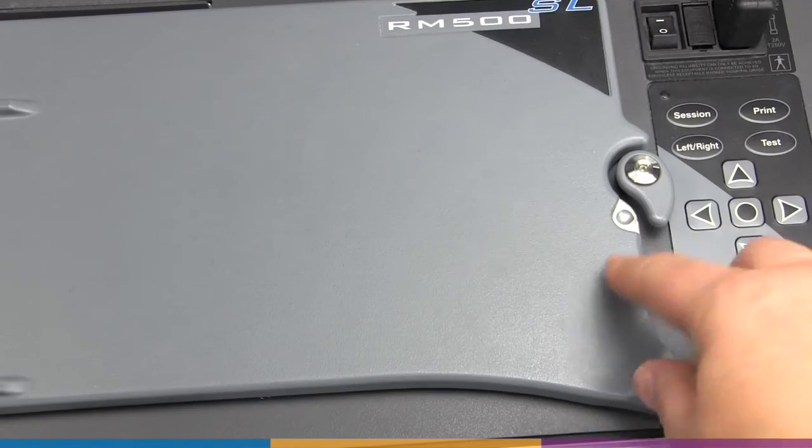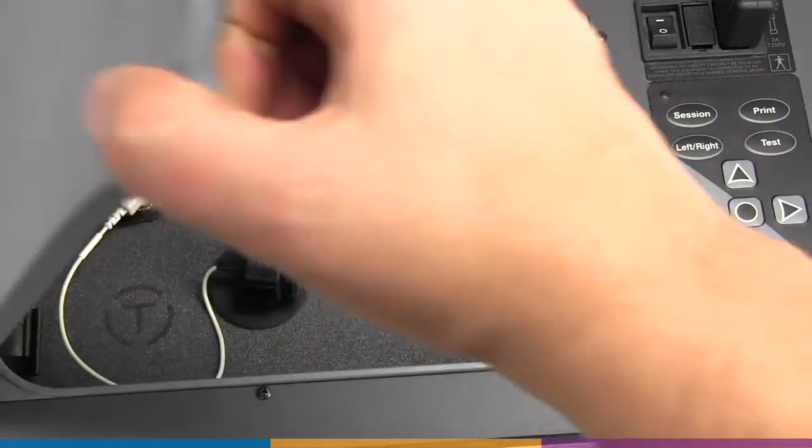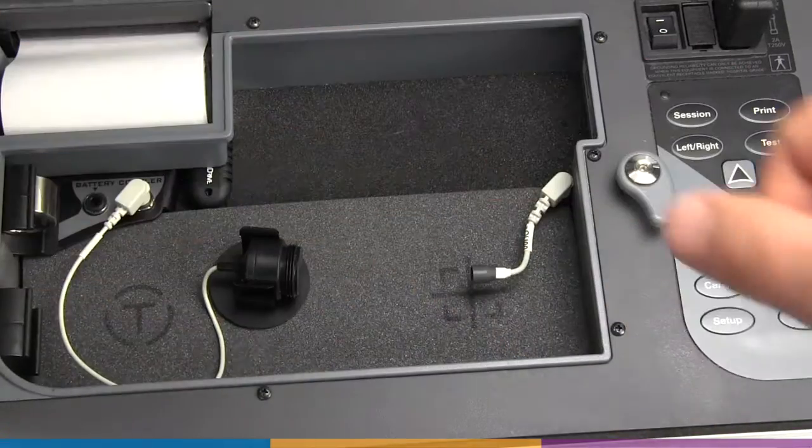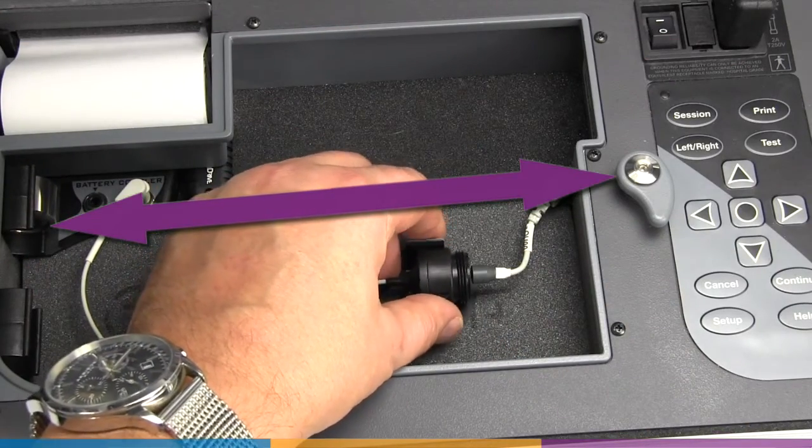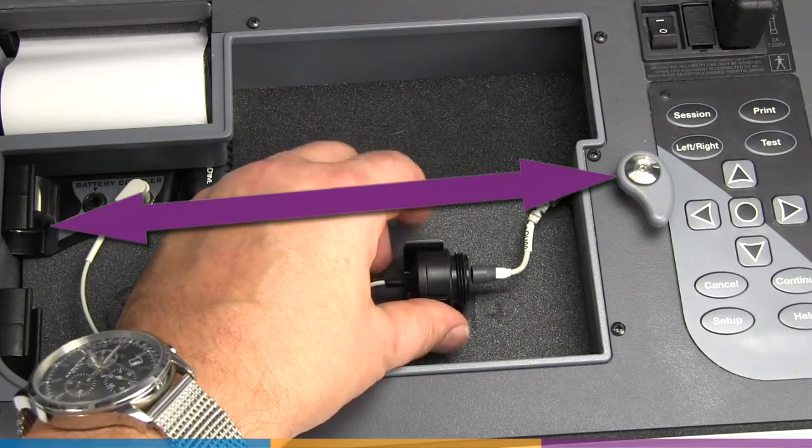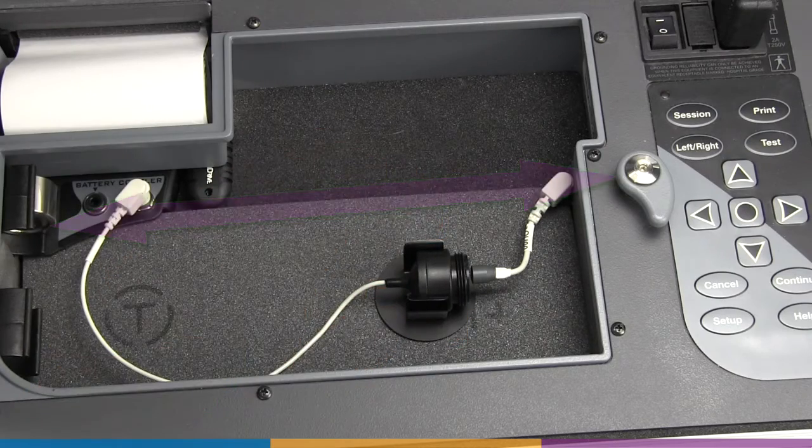For RM500SL and Axiom, it's best to position the microphones in a transverse fashion, horizontally in the TestBox.